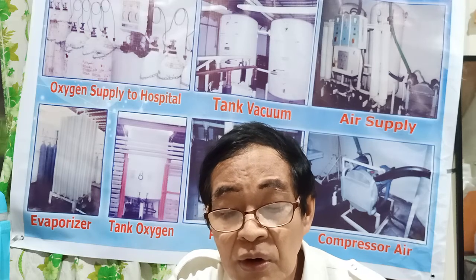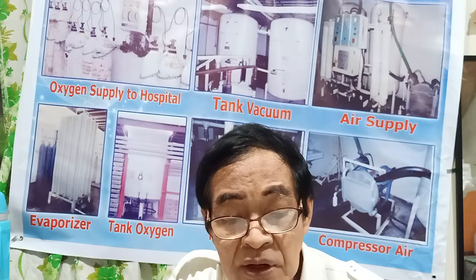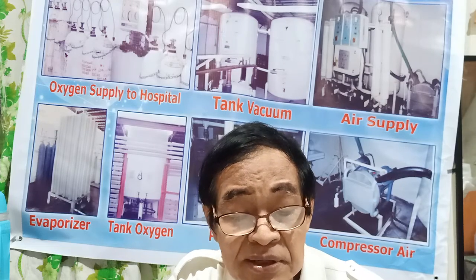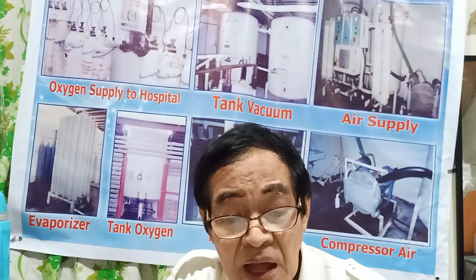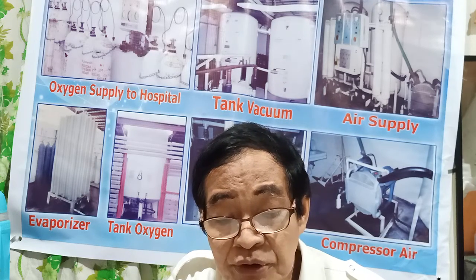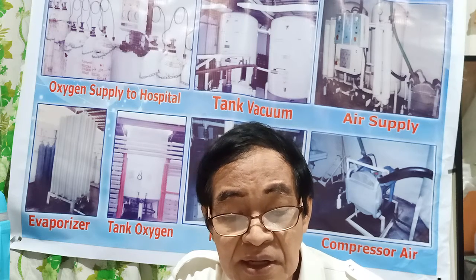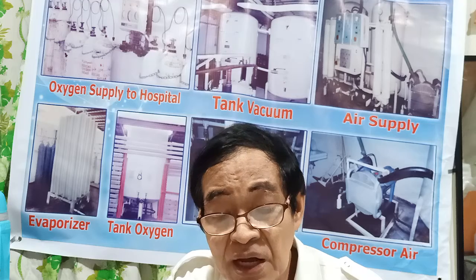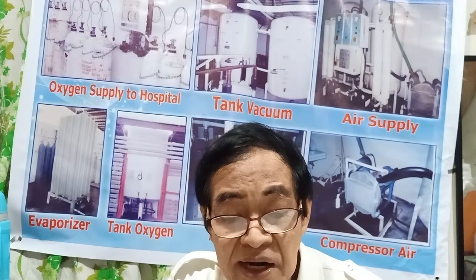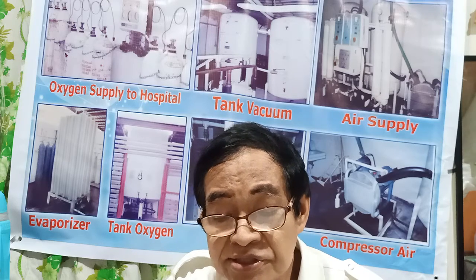The cold gas lowers the temperature of the air, resulting in the formation of mist. Mist will soon form close to the site of the gas discharge, and the result is the air has been completely replaced by the discharged gas.